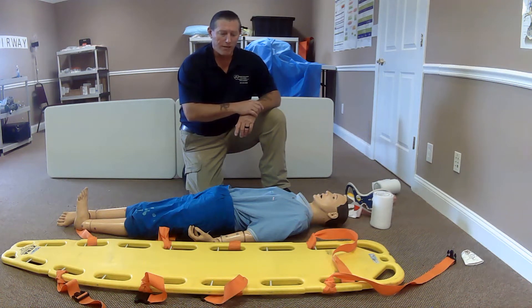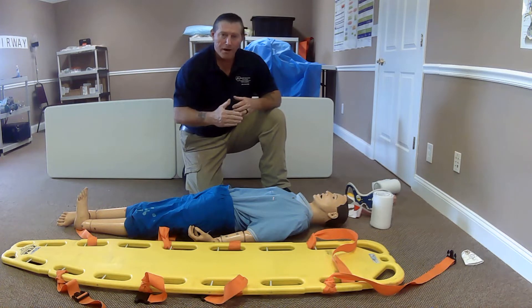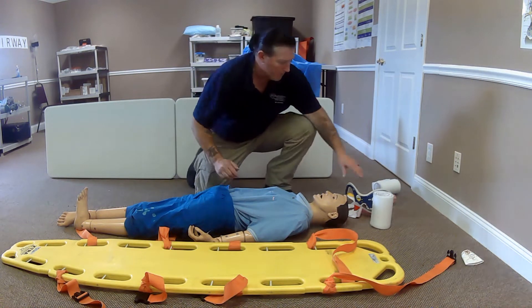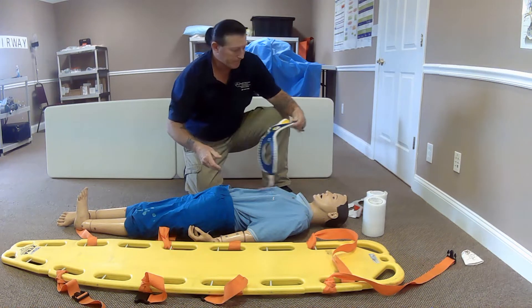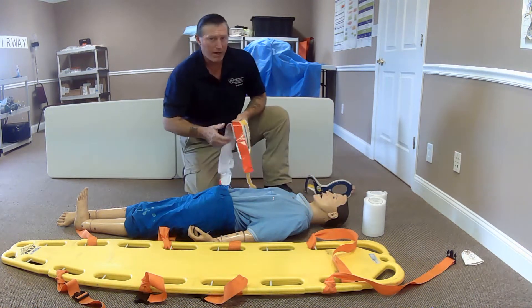This is going to be spinal immobilization of a supine patient. Before we begin, I'm going to check my equipment. I've got my patient, my backboard, two head blocks, my cervical collar, and some tape.